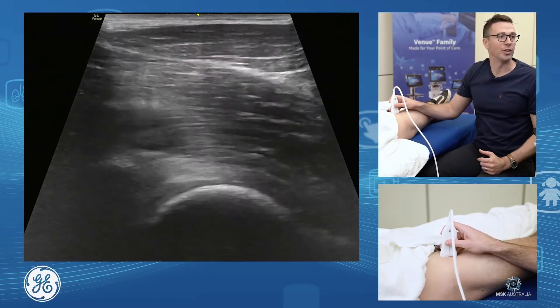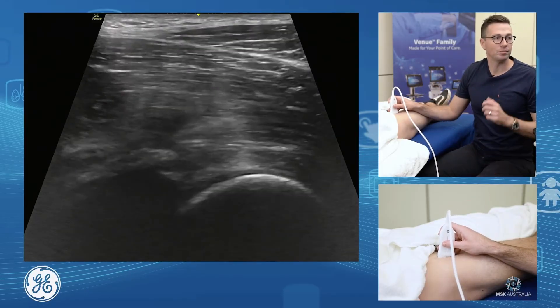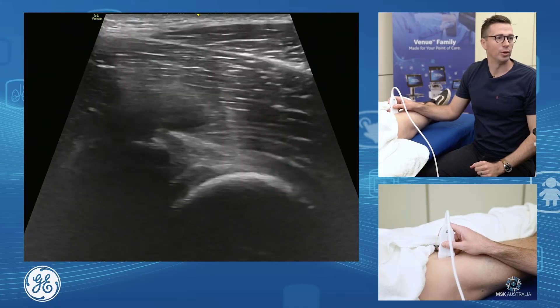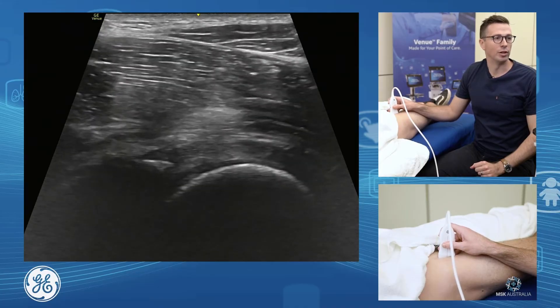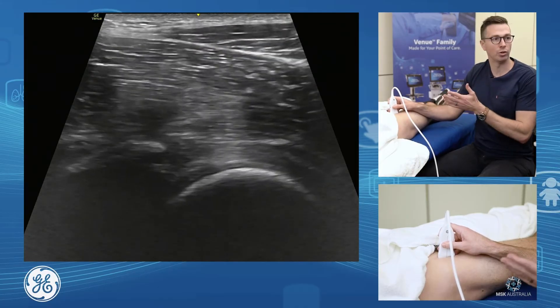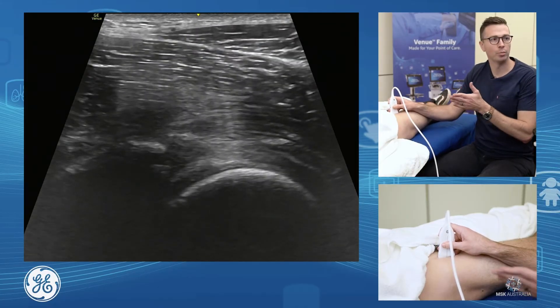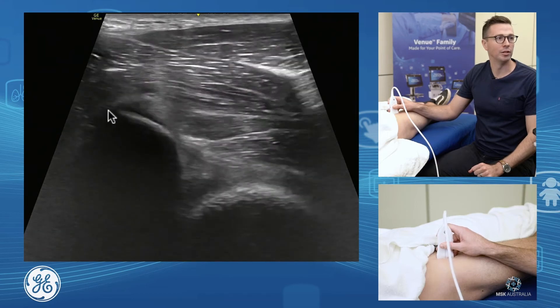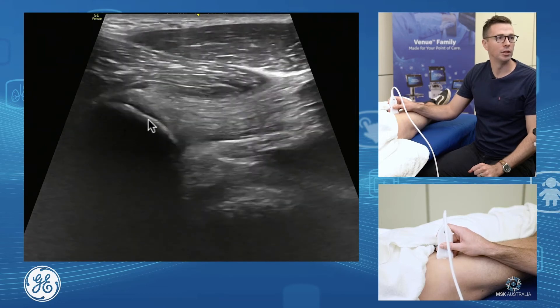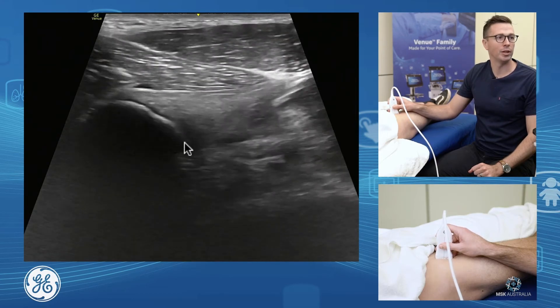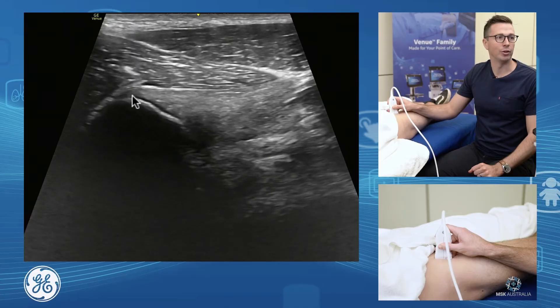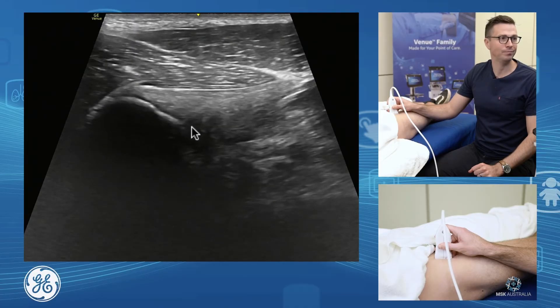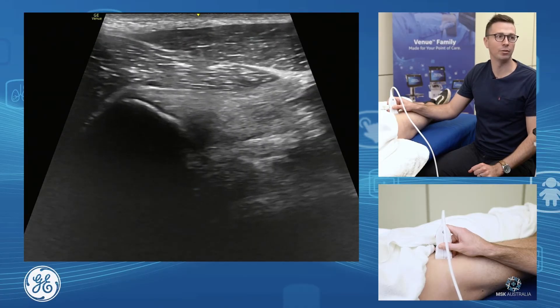The other structure we want to assess at the front of the hip is our rectus femoris. From the front of our hip joint in longitudinal, we move our probe laterally and slide out to where we rise up onto our anterior inferior iliac spine. This is our rectus femoris direct head.